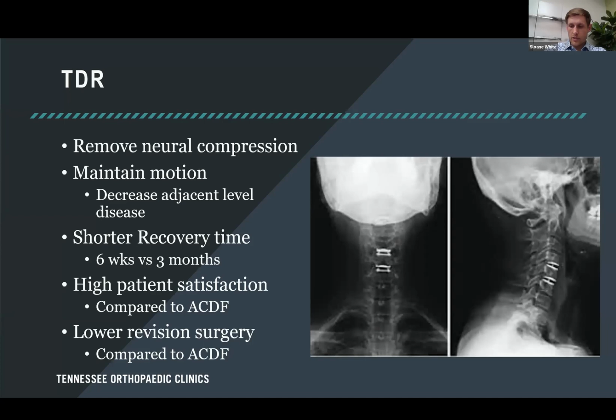The reason that the total disc replacement is such a good option for those that qualify is that it maintains motion at that level. Now, it's not the same God-given motion that you had as a baby, but it still maintains motion to take the stress off the other levels. And from good research in 10 and 7-year studies comparing it to a fusion, there's been a significant decrease in adjacent level disease.